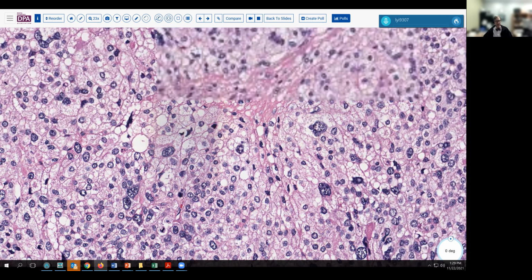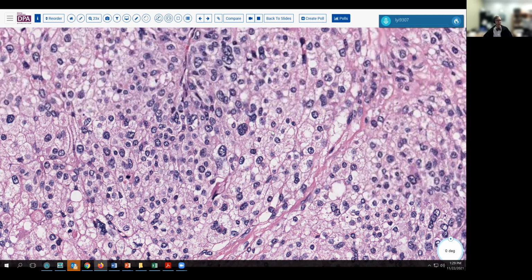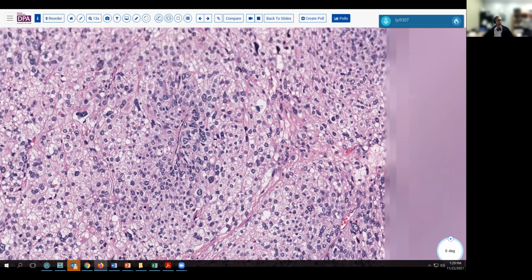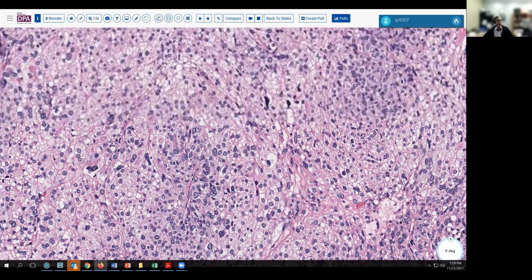So finding diagnostic lipoblasts, demonstrating them by that indentation characteristic into the nucleus that we've illustrated here, and which you can see as you study these slides in greater detail, is pretty much the diagnostic finding for this tumor. These are very pleomorphic tumors, and that is an indication of a great degree of cytogenetic complexity and molecular diversity in terms of the various mutations that accrue and present and drive this neoplasm.